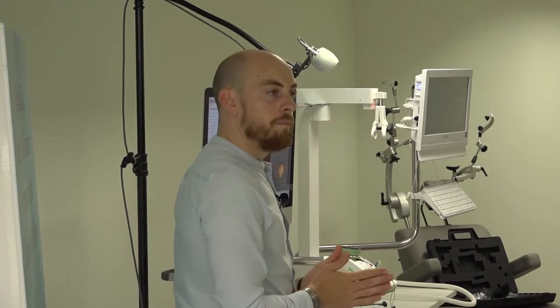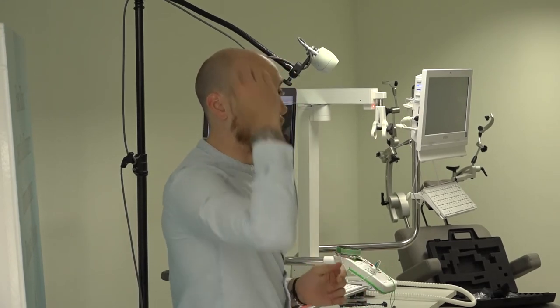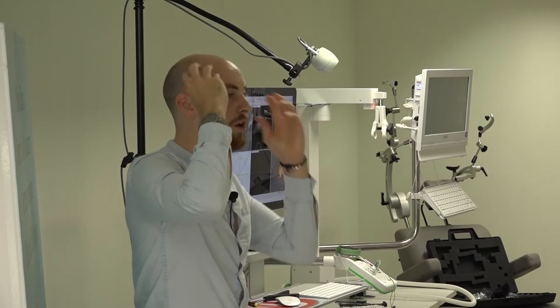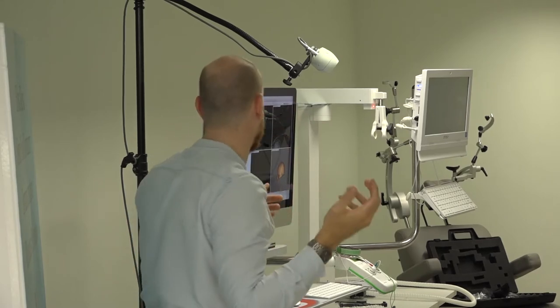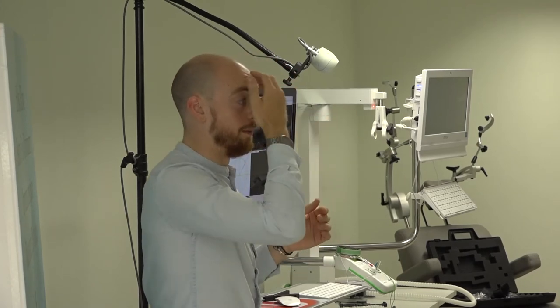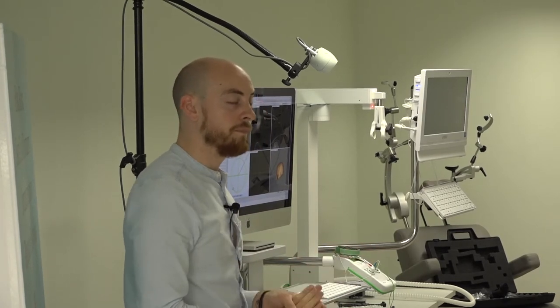How many spots can it save? How many landmarks? As many as you like. It's unlikely you'd be setting loads of landmarks. You wouldn't normally be stimulating the motor cortex and the frontal cortex and something else in one session; you'd probably be only stimulating one area of the brain. But in terms of landmarks, you can set as many or as few as you want.